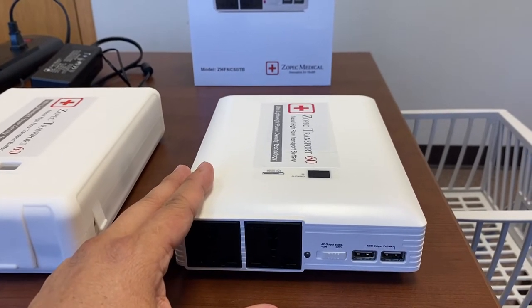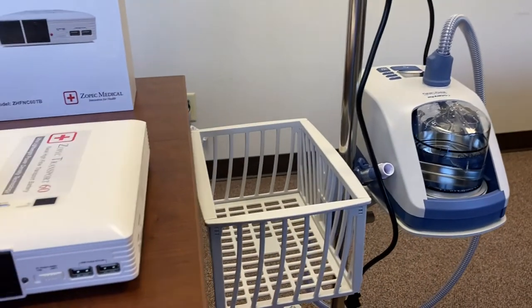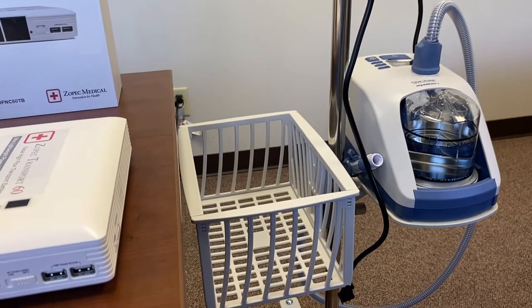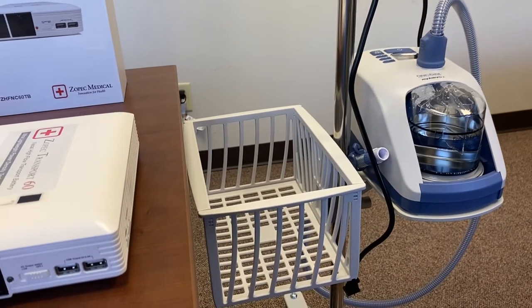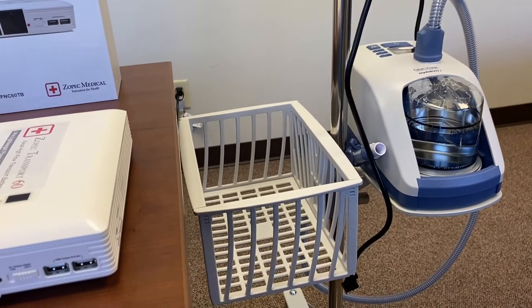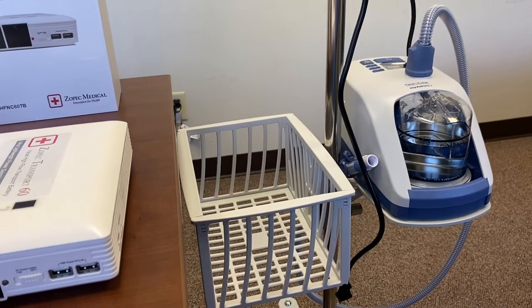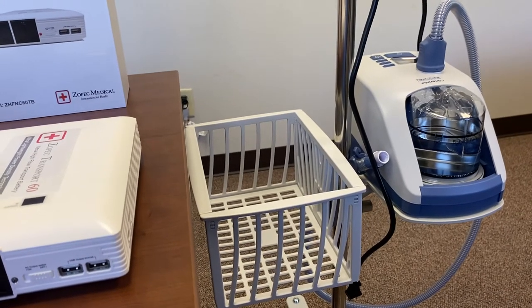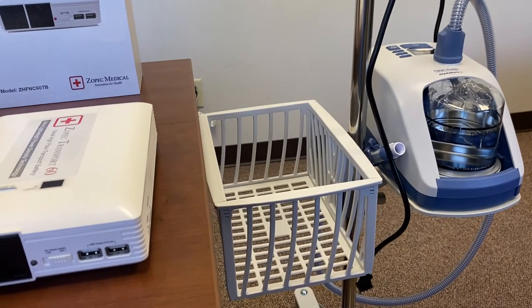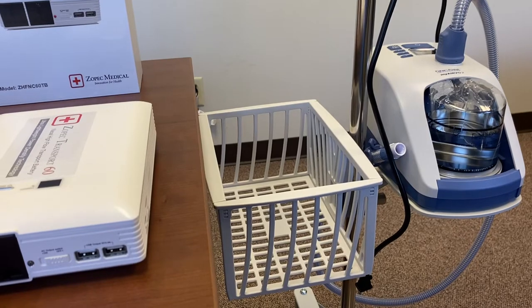If you unplug the AirVo2 to plug in the battery, the AirVo will reset. If you need an uninterruptible power supply so the AirVo2 will not reset when unplugged, we do have the Transport UPS series — just ask us or your sales rep and we can help you with that.